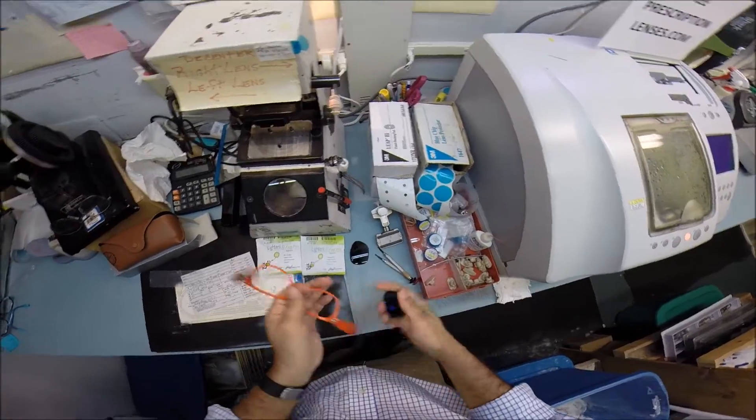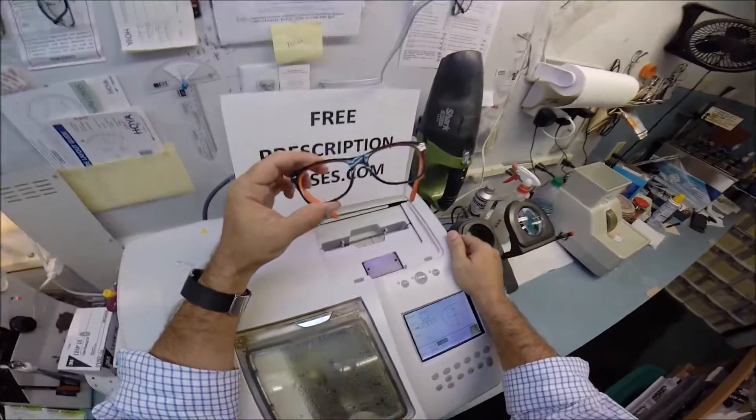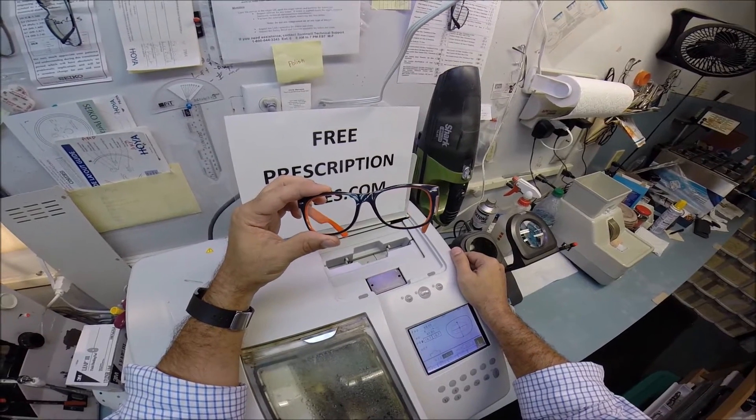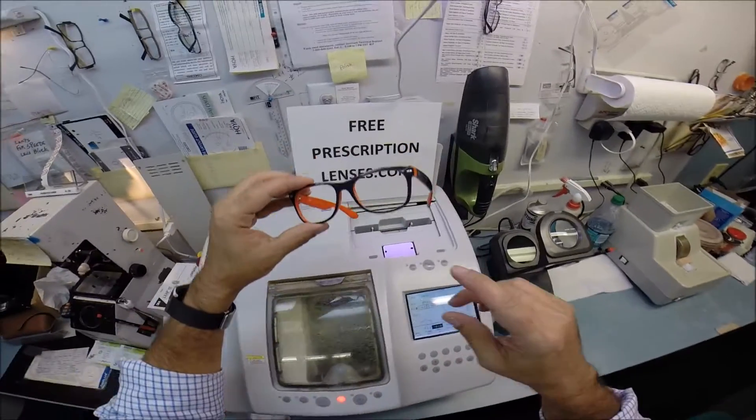These are the heavy glass original lenses that if you drop on the ground they will shatter or worse if you're hitting the eye and they crack. It will slice your eye wide open. Instead, I'm going to cut unbreakable bulletproof lenses to go in here.